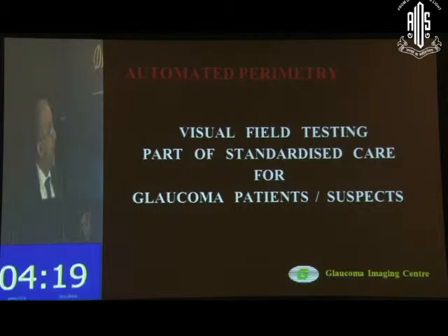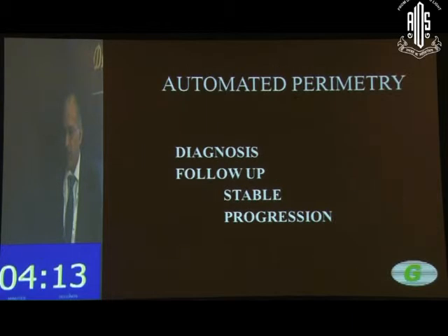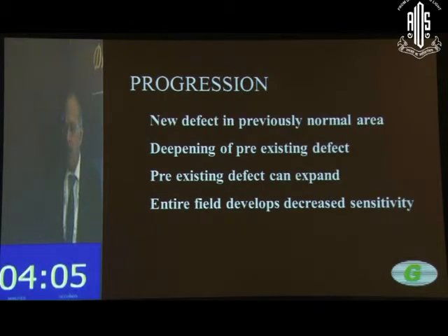Now, for this same reason, visual field testing should be a part of our standardized care for glaucoma patients or suspects. The other reason to do perimetry is to be able to assess whether the patient's glaucoma status is stable or progressing over time.